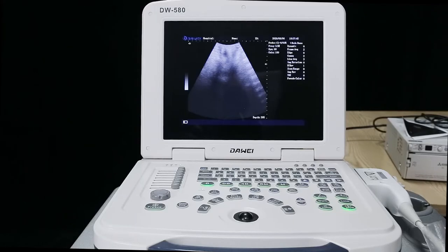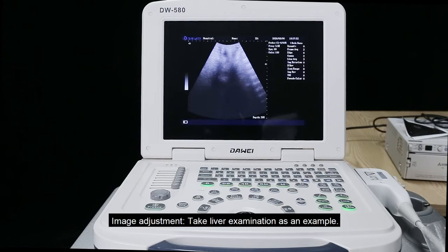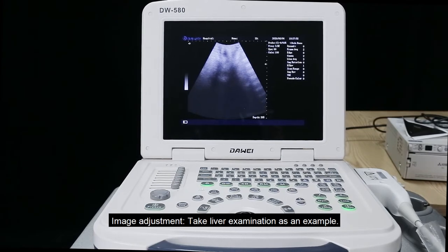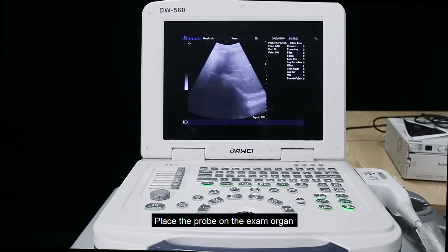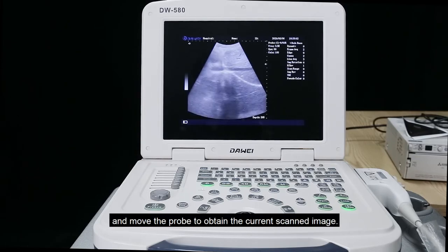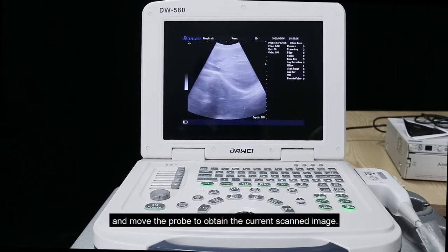Third, demonstrate how to adjust the parameters of the machine to get a clear image. Image adjustment: take liver examination as an example, place the probe on the exam organ and move the probe to obtain the current scanned image.